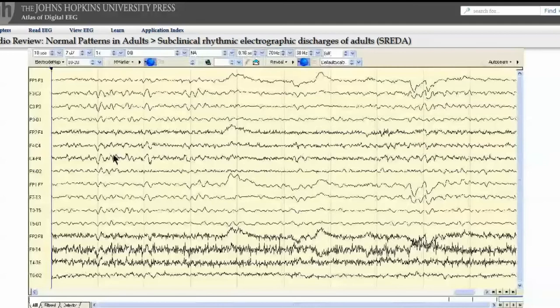So in summary, this is a pattern of rhythmic discharges, sometimes seen asynchronously, at other times synchronously, during which time the patient exhibits no symptoms. If the patient is drowsy, they will report no change in their thinking, and if tested, will awaken and not show any evidence of confusion.